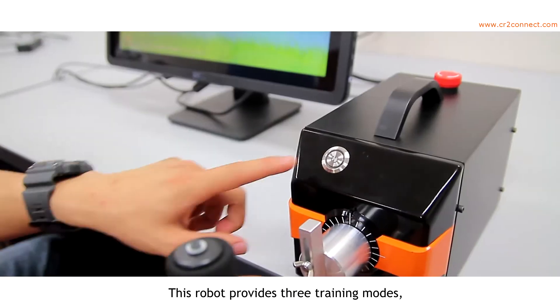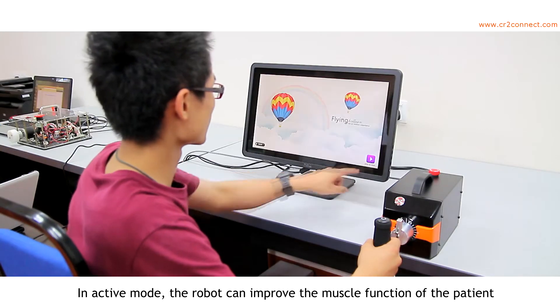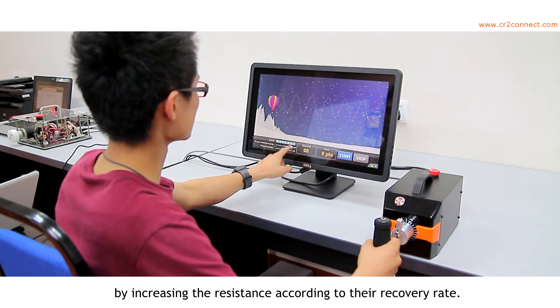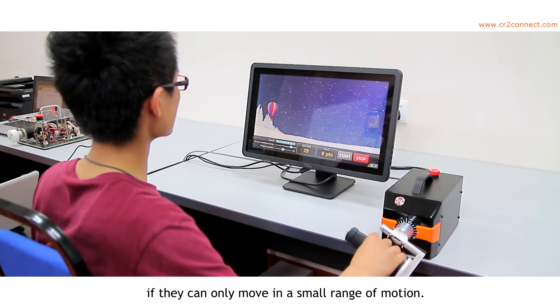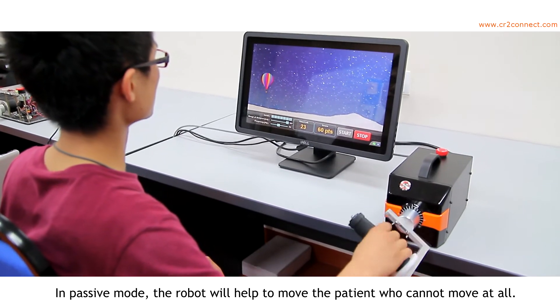This robot provides three training modes: Active, Assistive, and Passive mode. In Active mode, the robot improves muscle function by increasing resistance according to the patient's recovery rate. In Assistive mode, the robot helps the patient move if they can only move in a small range of motion. In Passive mode, the robot moves the patient who cannot move at all.